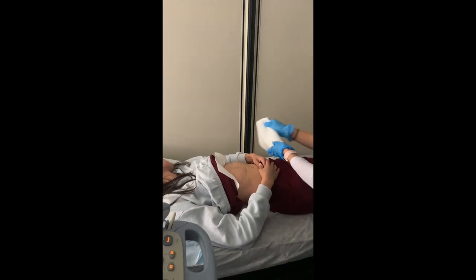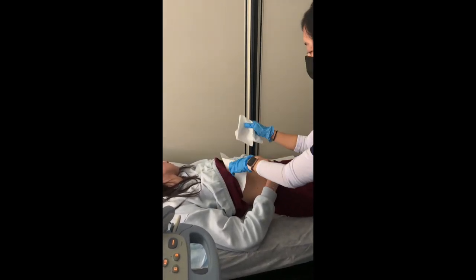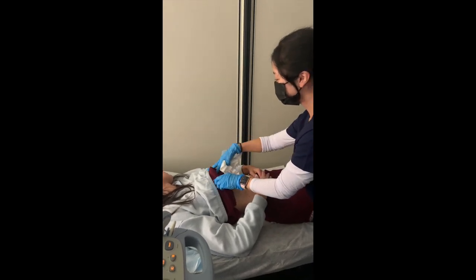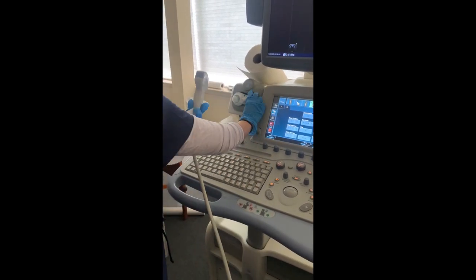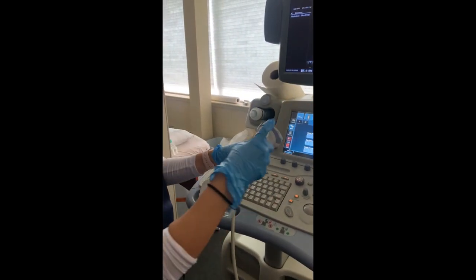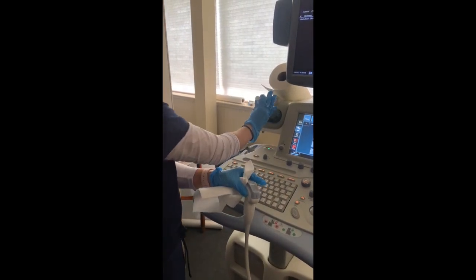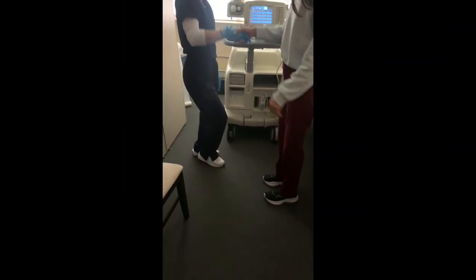At the end of your exam, remember to provide care to your patients and assist in wiping away the gel. Communicate that the exam is over and encourage your patient to get up slowly and recover any clothing. When the patient is recovered, say goodbye and wish them well.